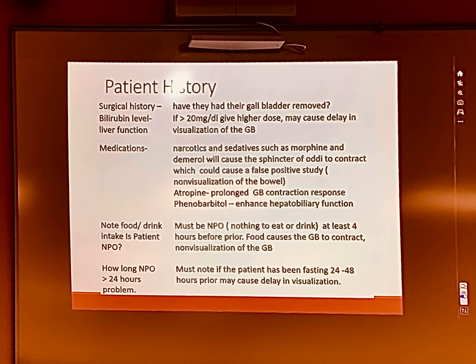If it's atropine and you're looking for an ejection fraction or just a regular imaging study, you're going to need to know that you're going to have a prolonged response. But your patient cannot be on any narcotics, morphine, Demerol, anything like that, or you will get a false positive study. Or false negative, false positive is more common.